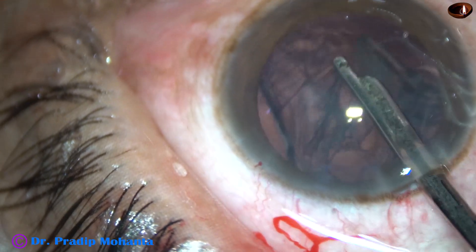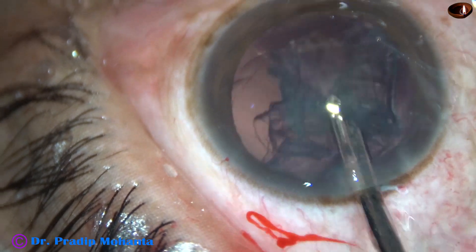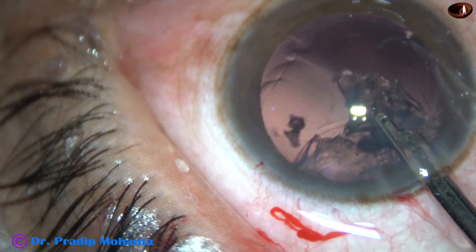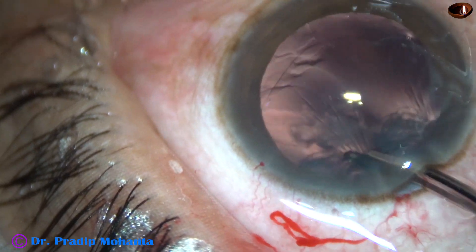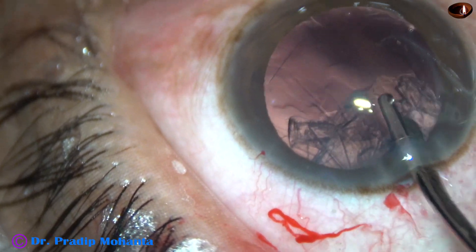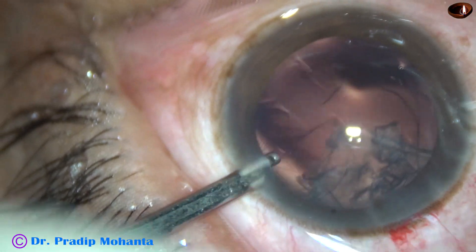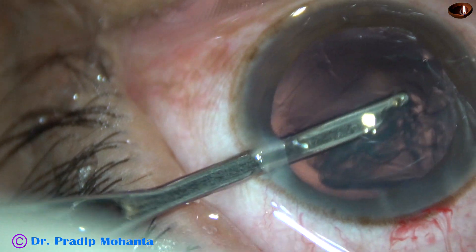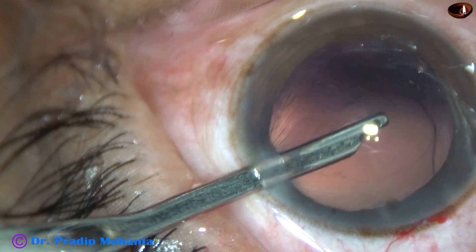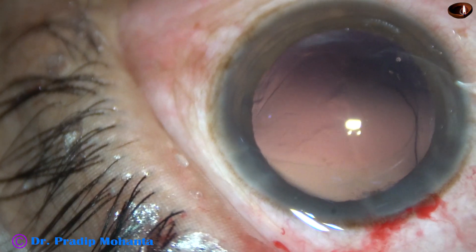And now I'm going to aspirate the cortical matter with a 23G Simcoe cannula. I have made only one side port. With the Simcoe cannula, I don't have to exert a lot of pressure on the posterior capsule. But if I use bimanual irrigation-aspiration, the fluid will exert more pressure on the posterior capsule, and there is a possibility of extension of the rhexis posteriorly.